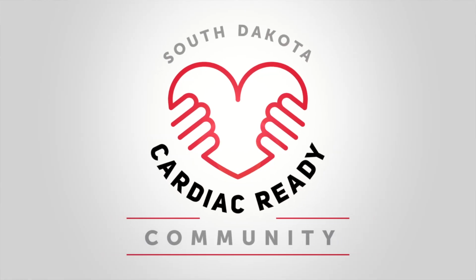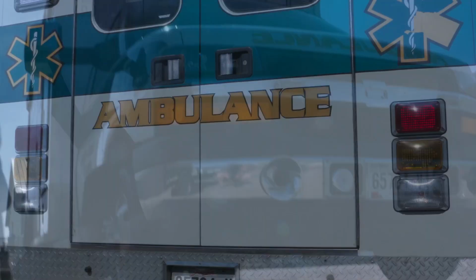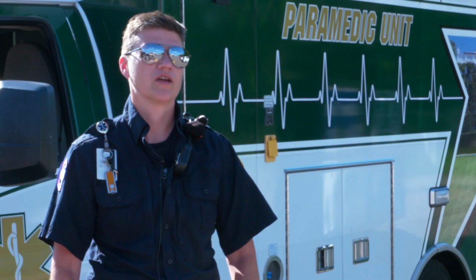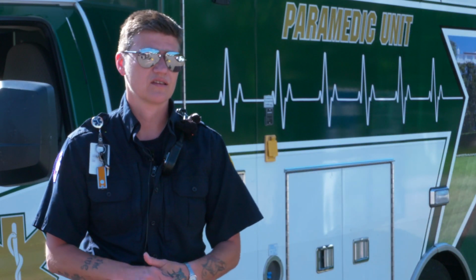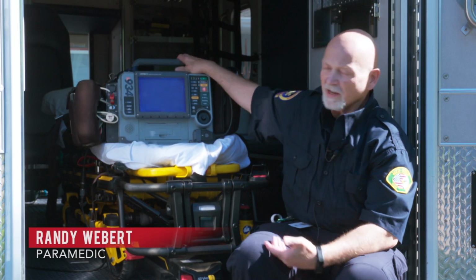First responders, so the fire guys or the EMRs, are usually first on scene and already have an AED, and they already have it on the patient. When we get on scene, most of them are compatible, so we can unhook them and hook them into ours, but probably every call we go on that's cardiac arrest, we use an AED or the defibrillator in our machine. It's called a LifePak 15.